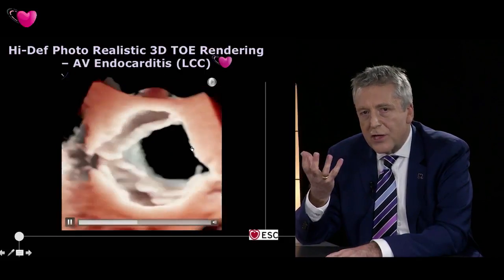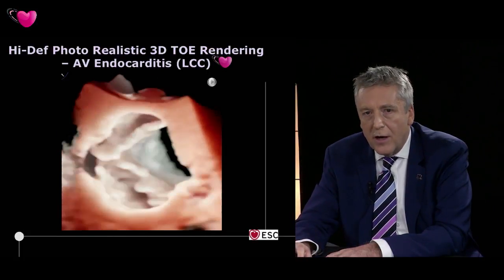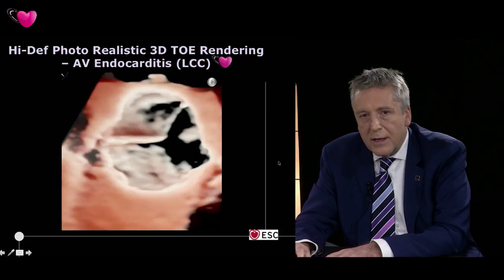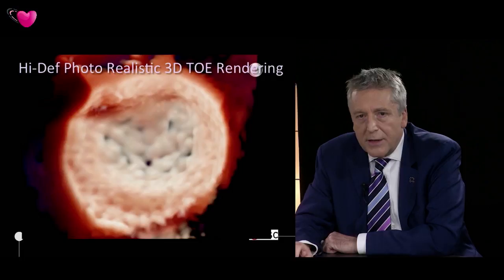So you can see how the shadow changes on the valve, and you get a much more realistic appreciation of the valve anatomy and pathology. And this is a mitral valve in a patient who's about to undergo a Cardioband procedure.